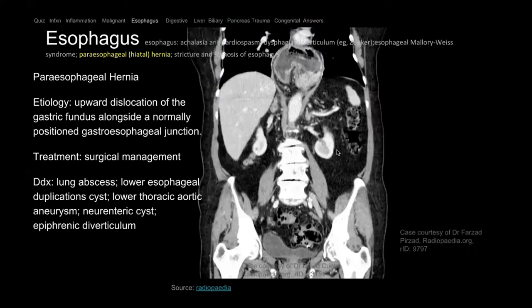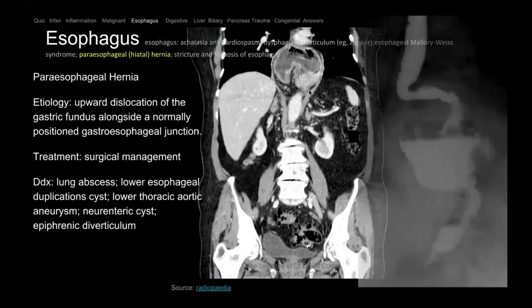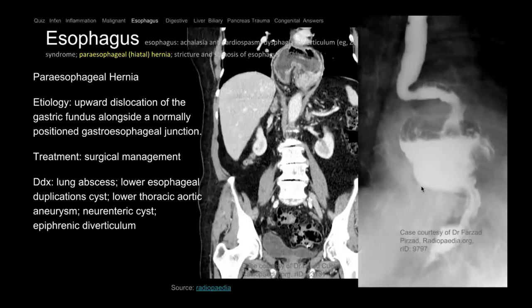Here on CT, the stomach has gone up into the chest cavity — that's called a hiatal hernia. There are different degrees — the whole stomach can be inside the chest. On this esophagram, the heart is in the background, the diaphragm is here, and part or majority of the stomach is in the chest. This is a hiatal hernia and sometimes causes dysphagia requiring surgical correction.